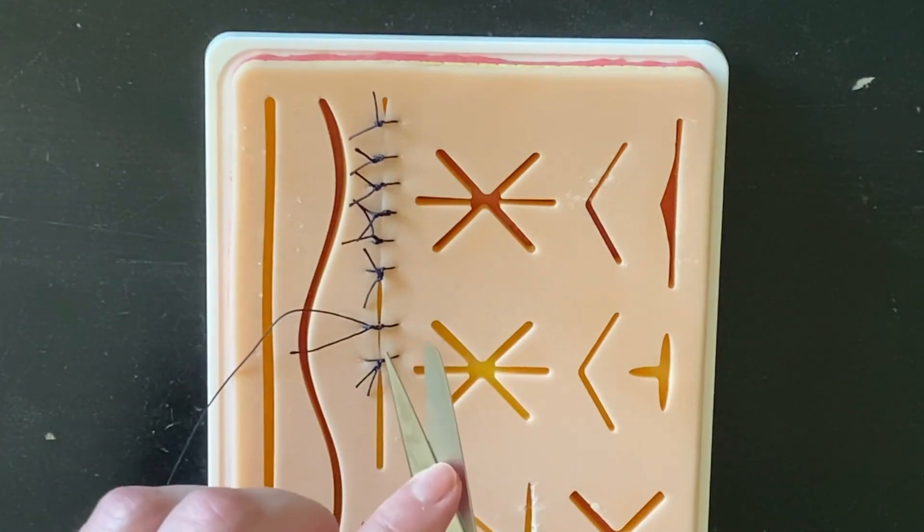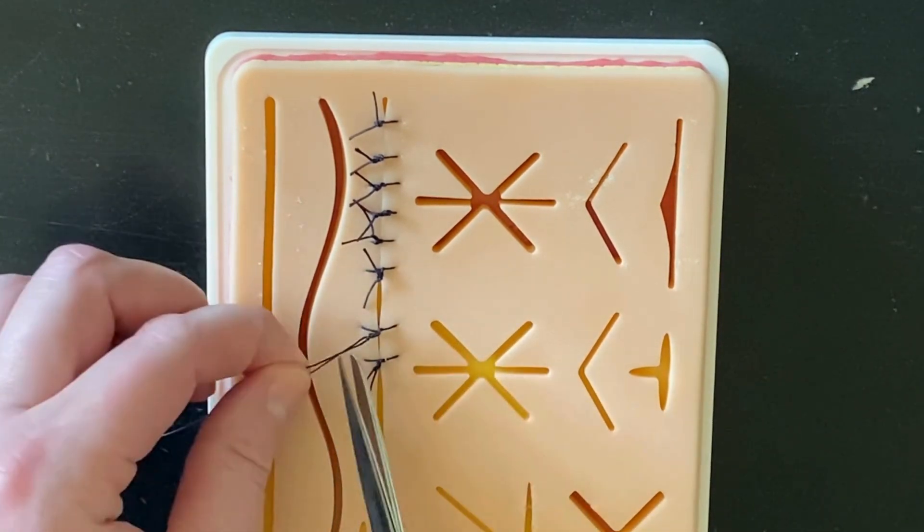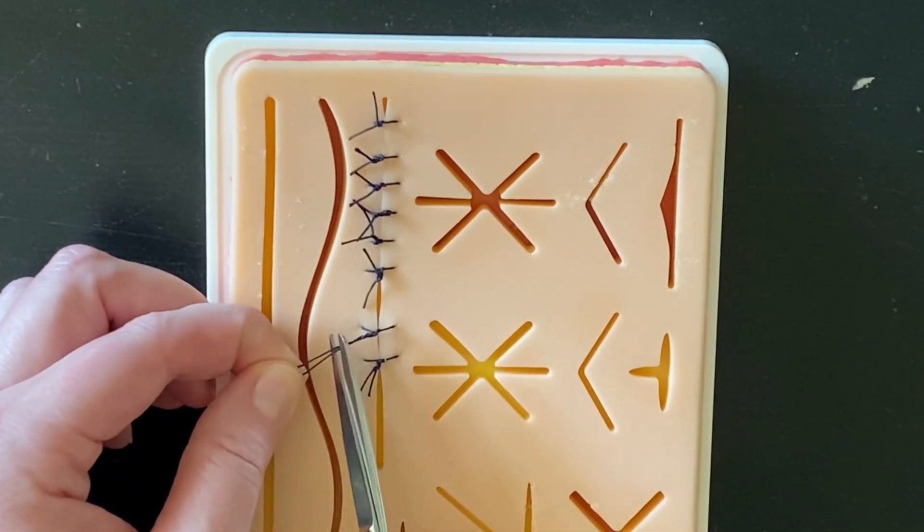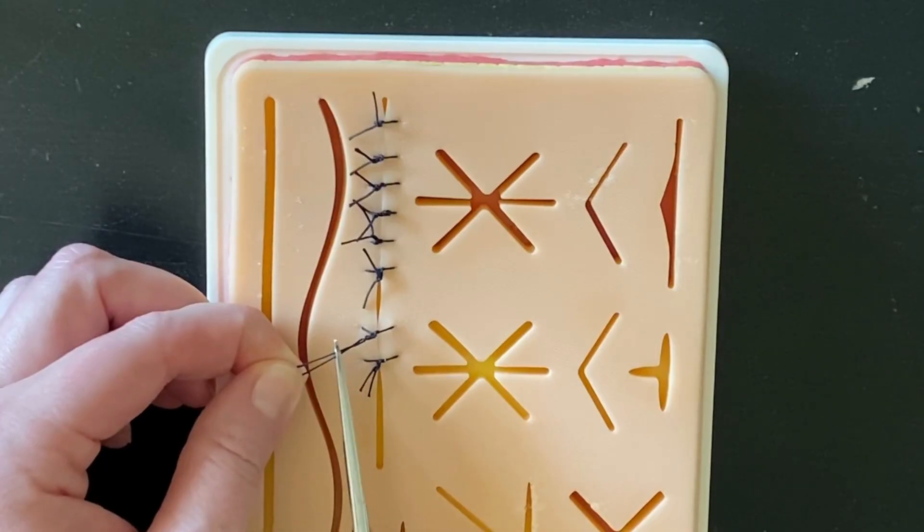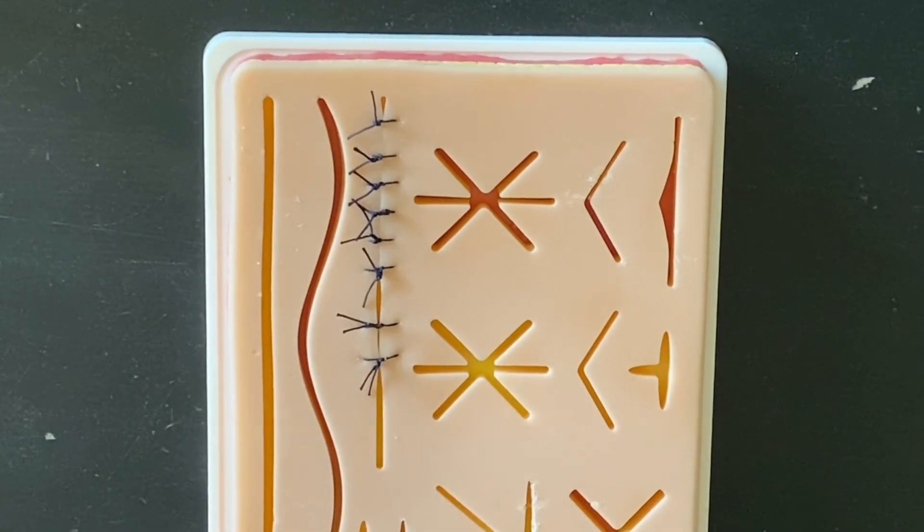Again, you're not cutting deep into the crotch of those scissors. You're going to be cutting down to the knot and backing away as far as you want and cutting just at that mark. Usually the surgeon will say leave four millimeter tails, one centimeter tails, or longer if necessary.